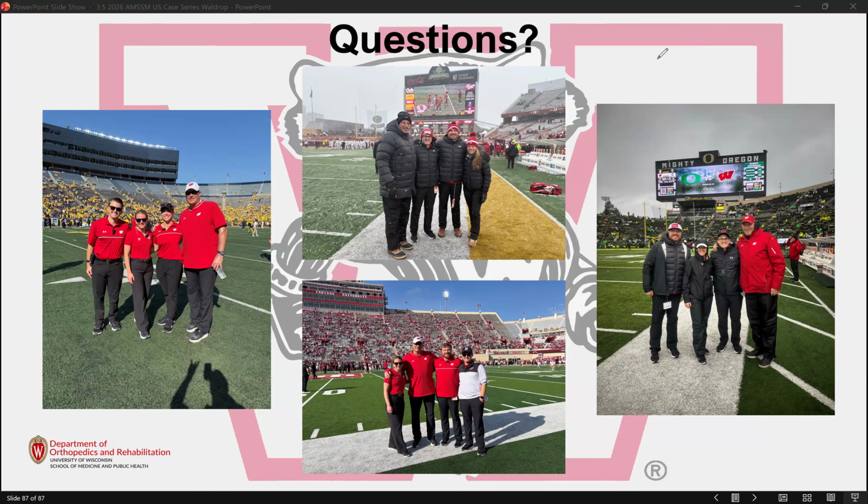This is Doug Hoffman. Really nice presentation and review of the medial knee structures. I was going to piggyback on what Dr. Schaff just said. In the setting of first doing an ultrasound, if you did not see a knee effusion and saw a Morel-Lavallée lesion, would you be comfortable proceeding from there, or would people feel like, okay, let's still get an MR?